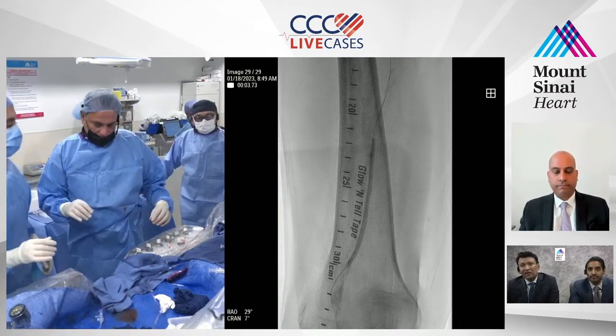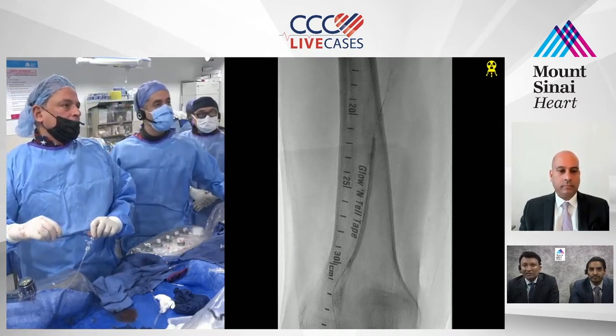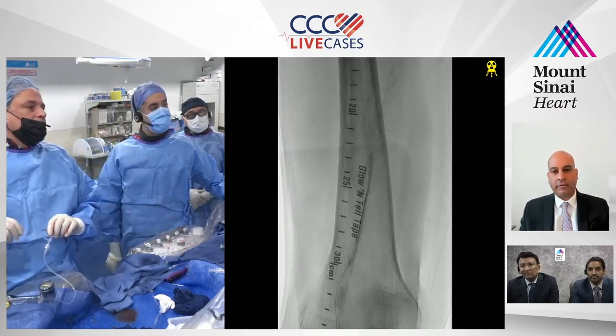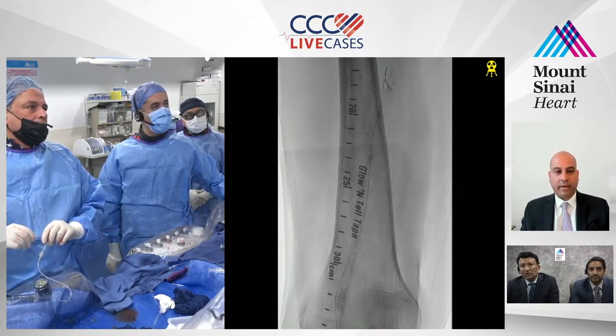It's bulkier. It'll strip off, and then now you're, I don't know. It's not a fun thing to do. If we look at the covered stent, this is a long CTO too, so the primary patency rate of the Viabahn in this case.